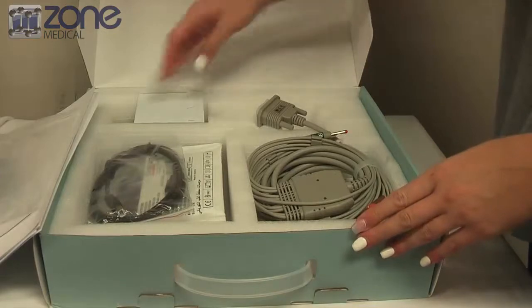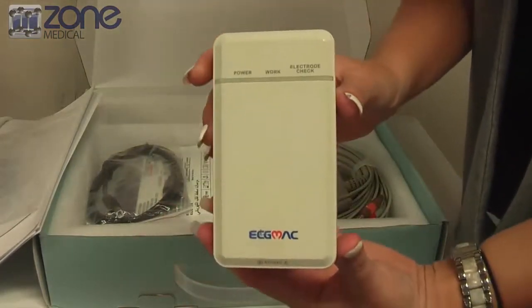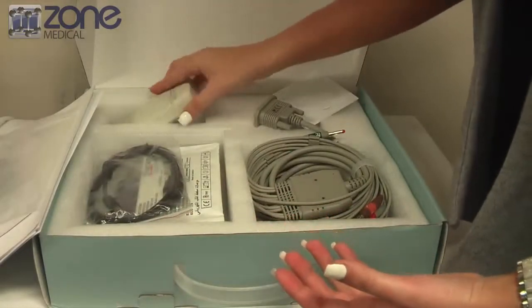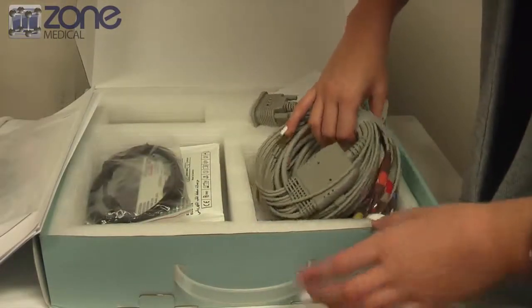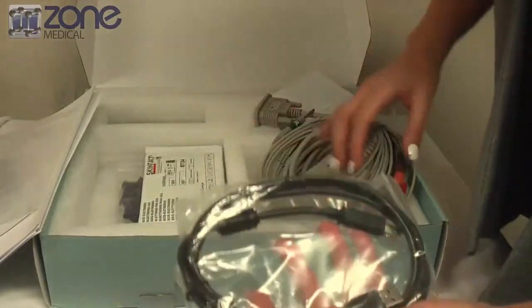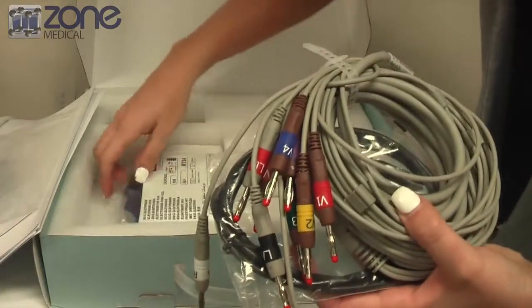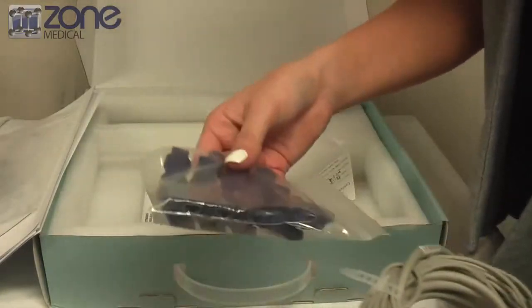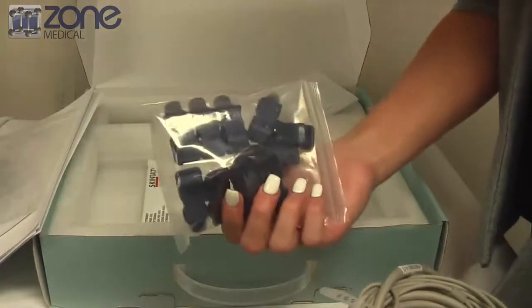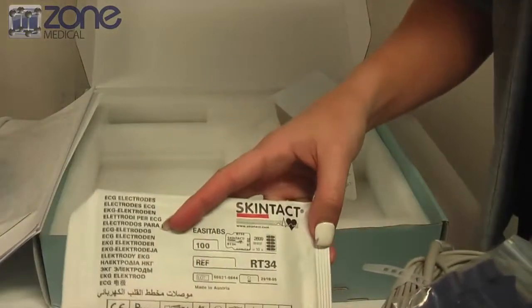This is the ECG Mac device itself and this is the acquisition box. There's also a USB connection cable that comes with the box, and there's also a 10-lead patient cable. The device also comes with ECG clips, which work with any electrodes. We also sell this ECG Mac with the skin-tacked electrodes.